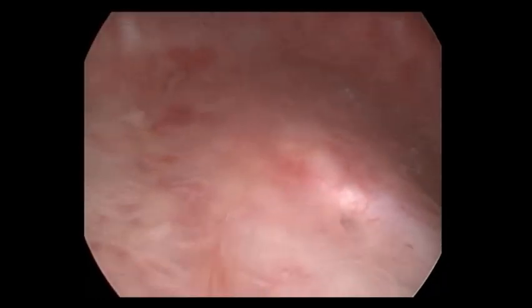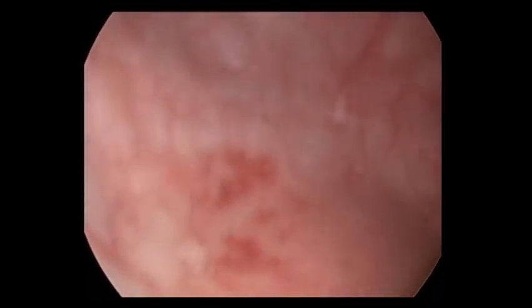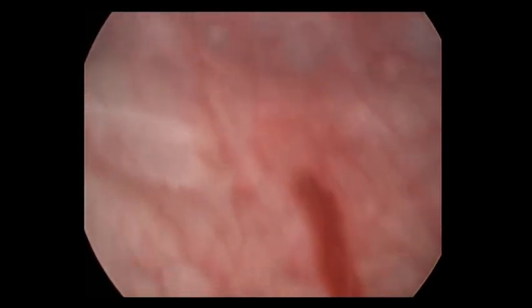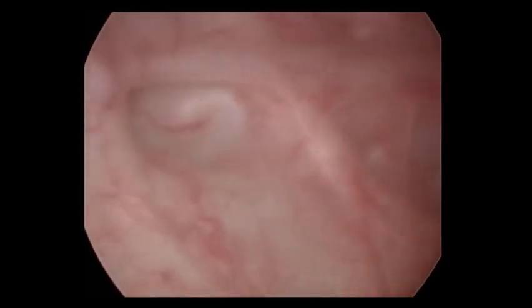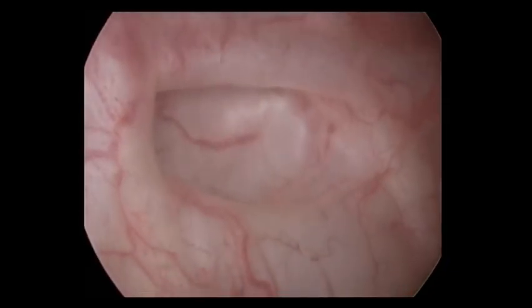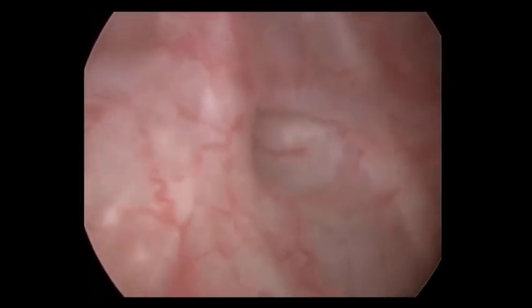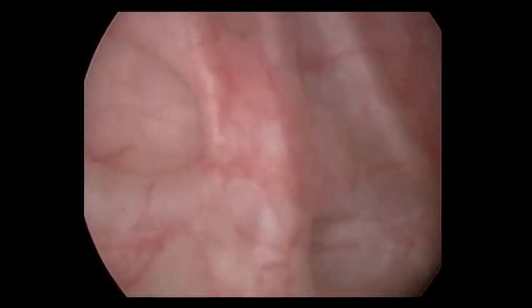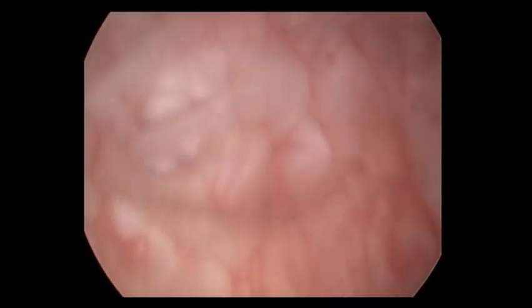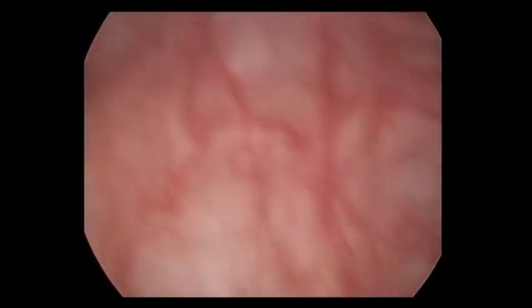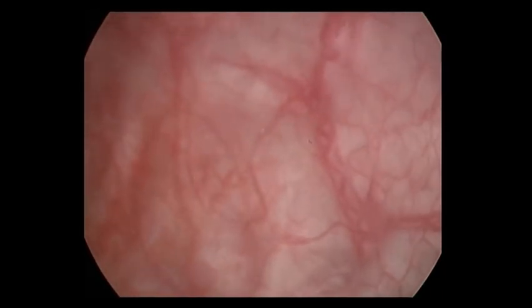Just towards the right side you can see a small bladder diverticulum with trabeculations, and another bladder diverticulum. Prominent blood vessels are also visible. All these features together characterize the chronic nature of the disease.